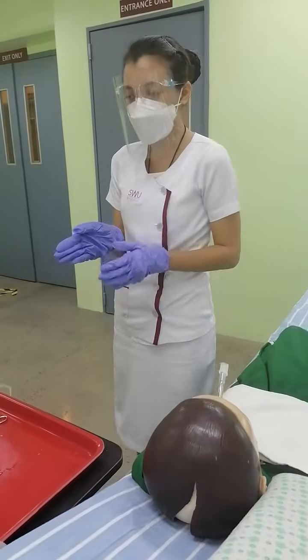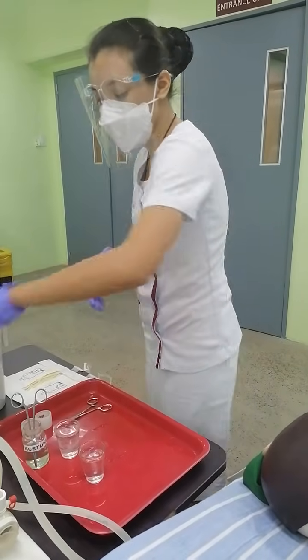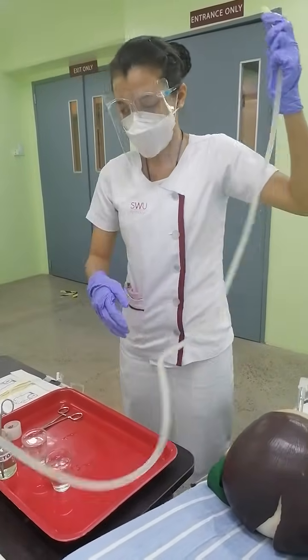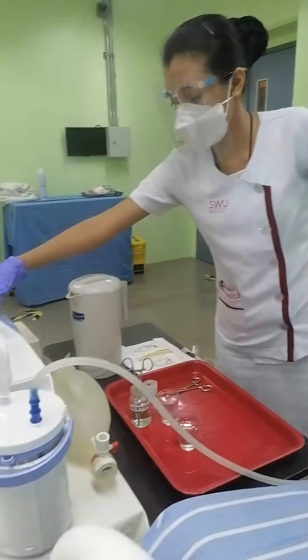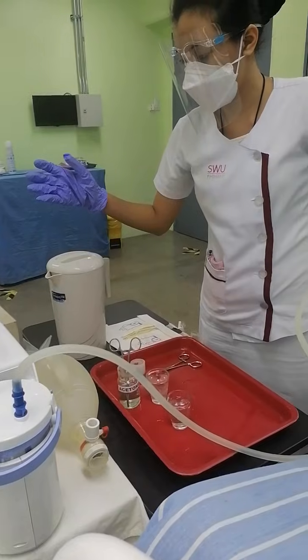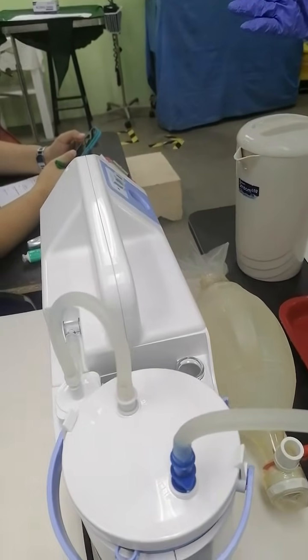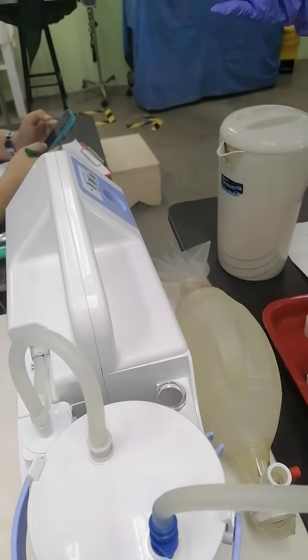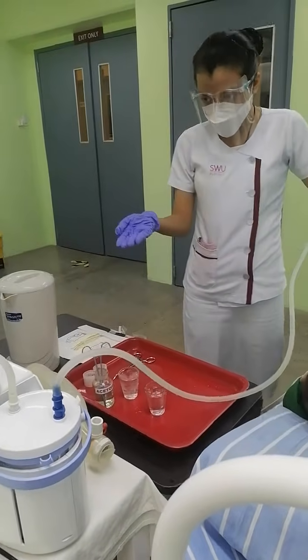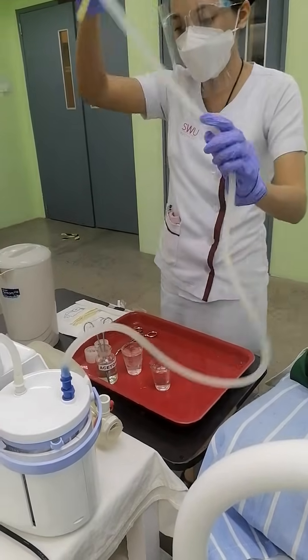Then I will check the functionality of the suction machine. First, I will turn it on, adjust the pressure, and turn it off. This is to check the functionality of the suctioning machine so that if it is defective, I can address the issue before proceeding with the procedure.